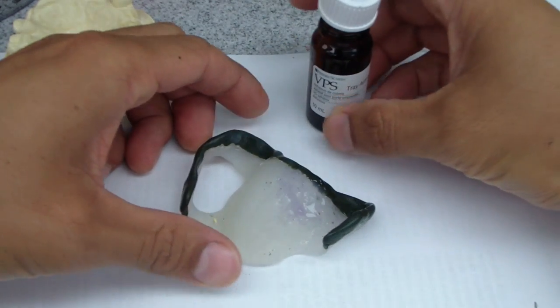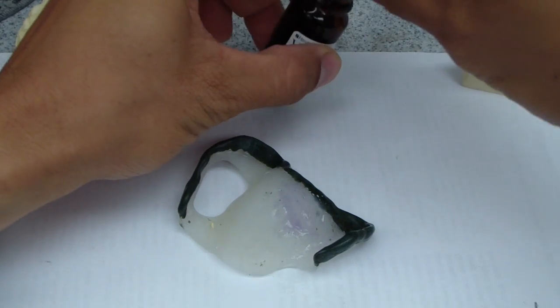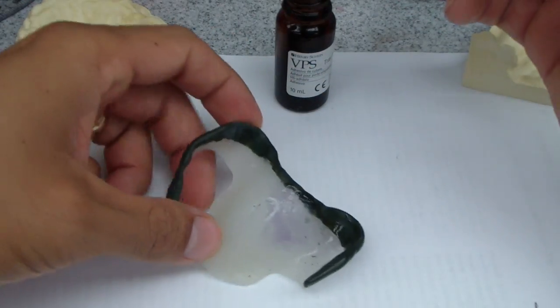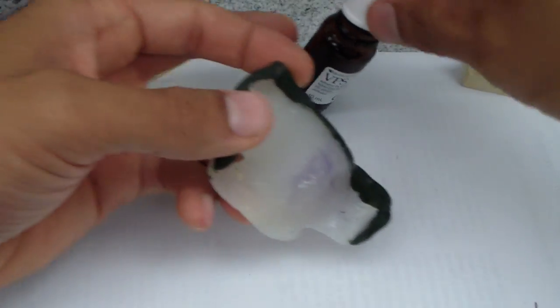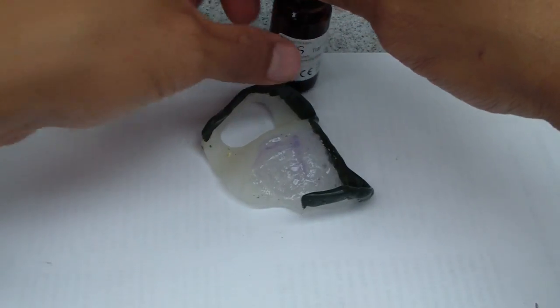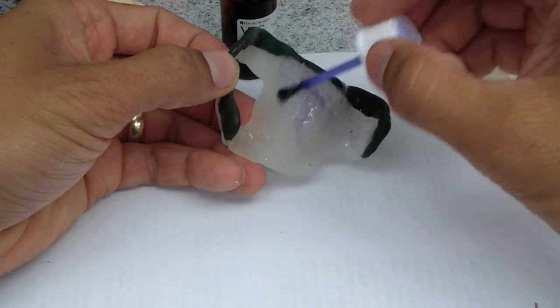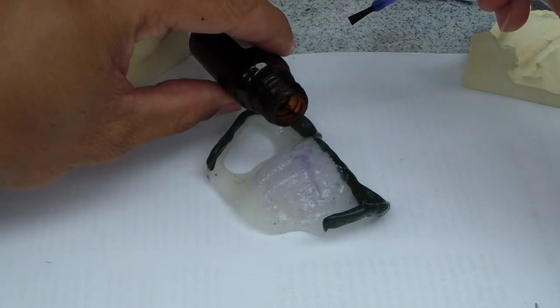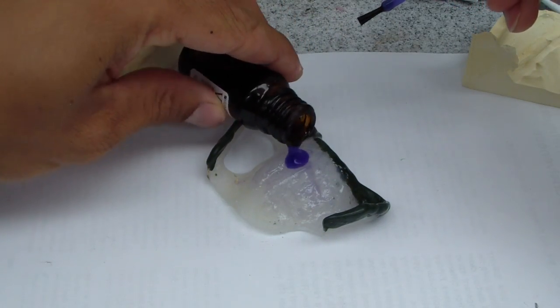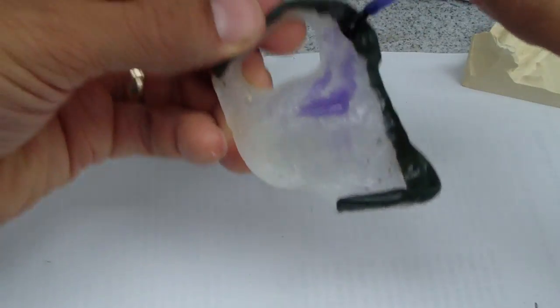Okay, so there are a number of studies indicating that adhesives significantly increase the retention of polyvinyl siloxanes, actually alginates as well, so we're just going to be taking some. Now this has been disinfected, so I can use the brush from the bottle. If not, just pour some on and use a disposable brush.